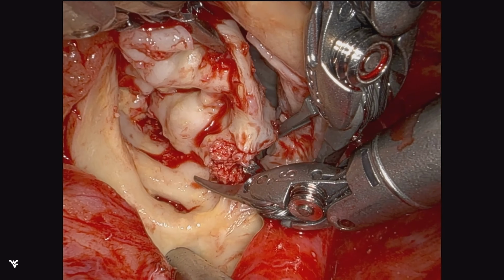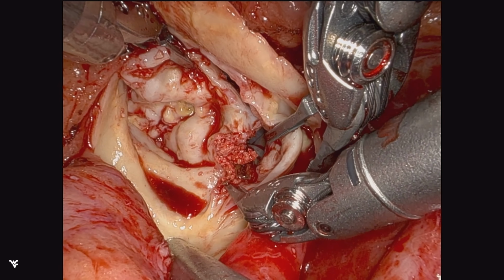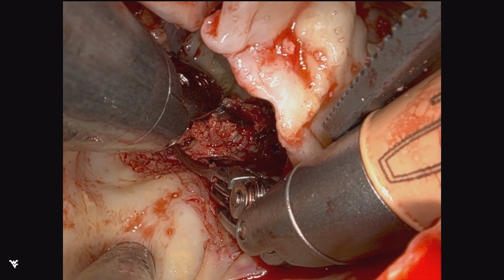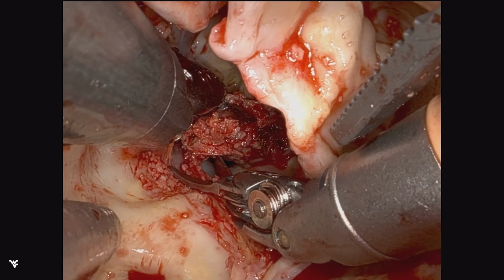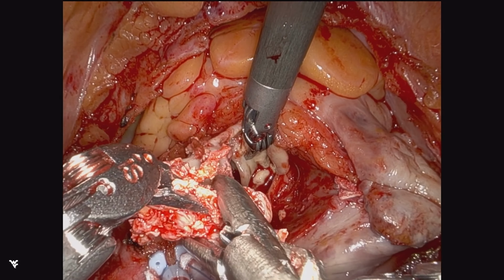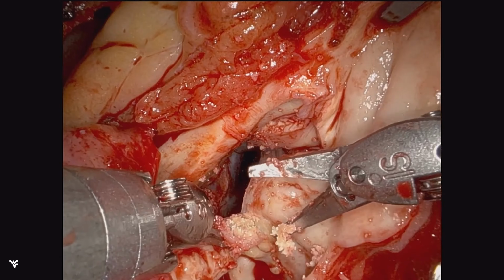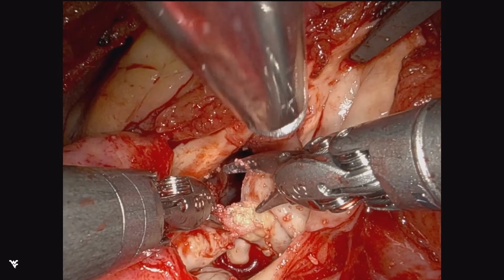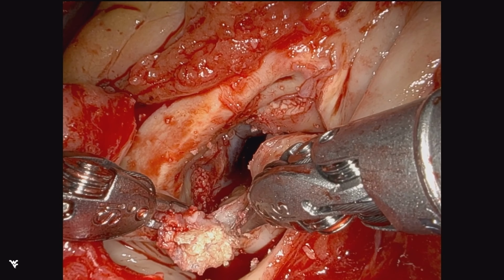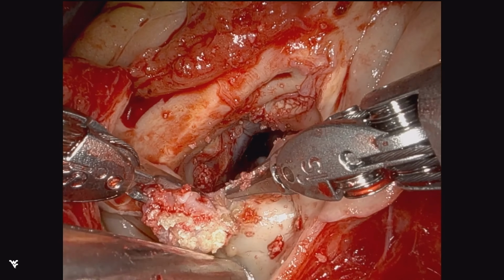So many of my surgical colleagues around the world will recognize these types of valves that we'll see in this episode that are difficult, but actually a nice challenge as we focus on precision. Here we see we're getting under the calcium. While it looks quite unruly now with all of this calcium, this is the same situation in open cases. We just have to be very precise.